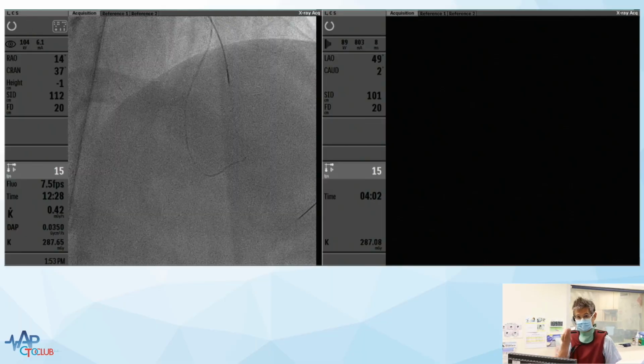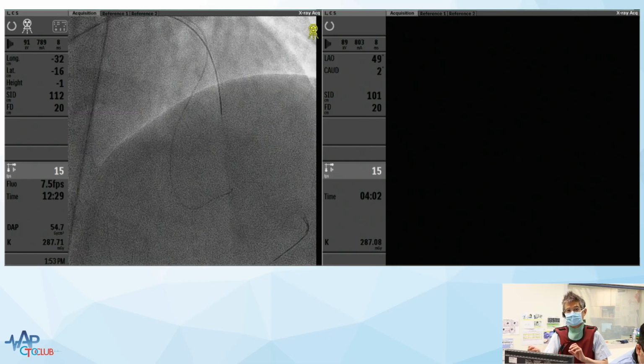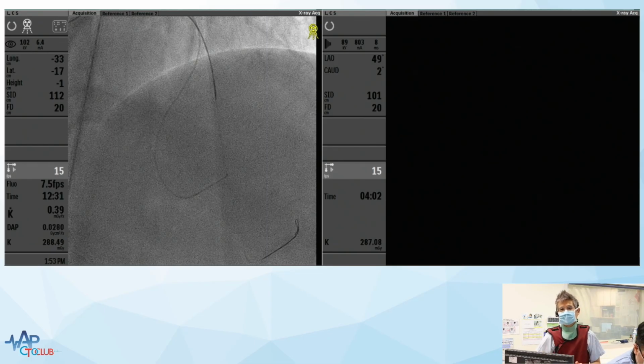Second, you can increase the strength of the retrograde, the antegrade microcatheter. You can use a Turnpike Spiral, or you can use something that's got more penetration force. And third, you can put a wire in the antegrade that touches the retrograde wire, so that you have some wire to track the body over.